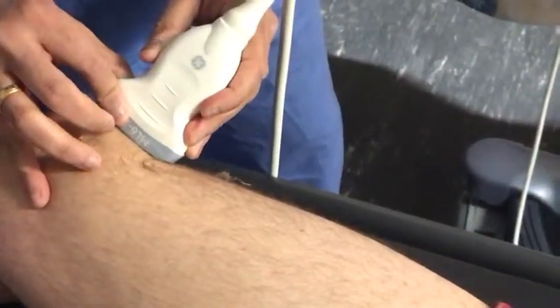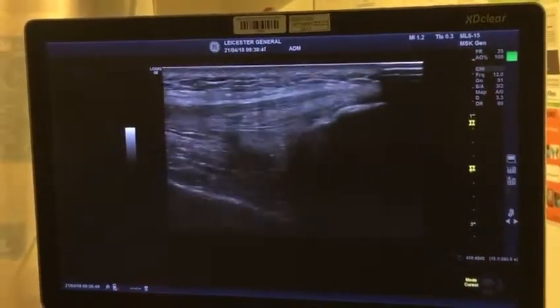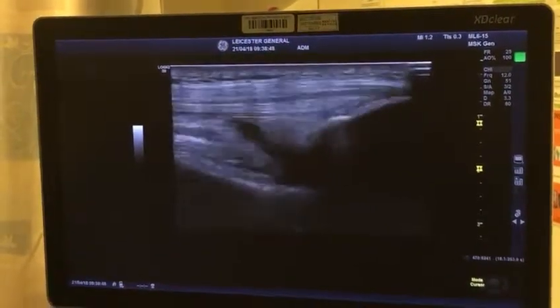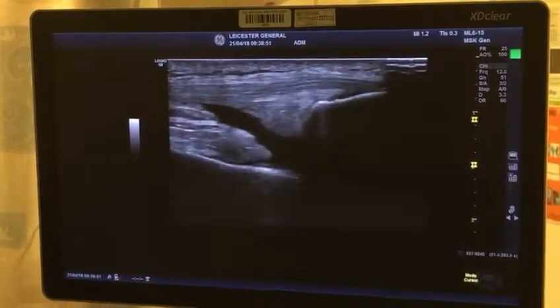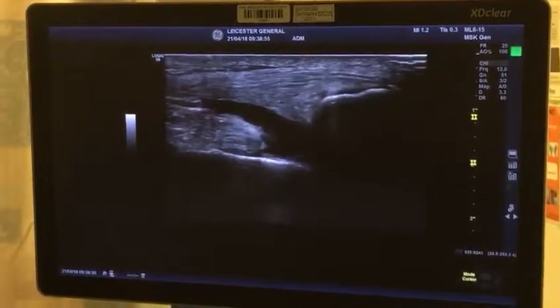I'm putting the probe on top of the patella — I can see the recess now. I can extend the recess by squeezing the fluid. Now I can see the recess nicely. I'm displacing the fluid by putting pressure and moving it around.